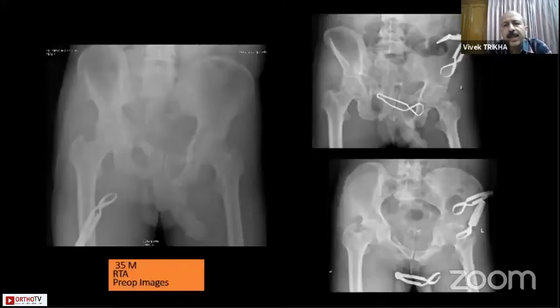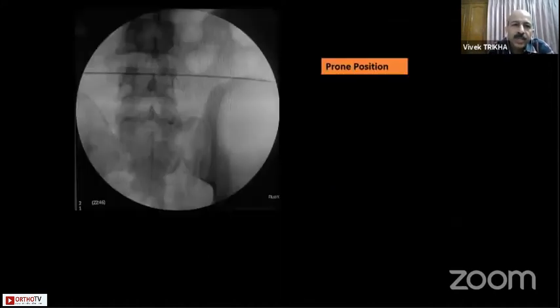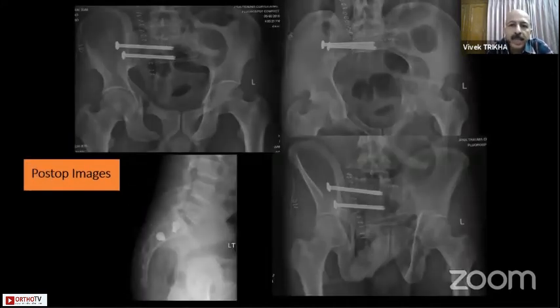In sacral fracture examples: undisplaced sacral fractures are a good way to learn how to put in an iliosacral screw, but the real indication is widely displaced fractures. In one case with both posterior and vertical superior displacement, I reduced the fracture prone by opening from the back, confirmed cortical continuity of the sacrum, stabilized with K-wires, then placed screws in S1 and S2 to get adequate fixation, achieving complete reduction of anterior-posterior and vertical displacements.